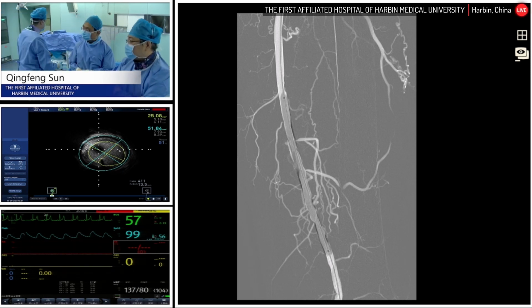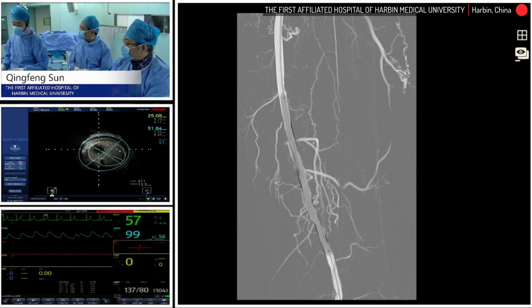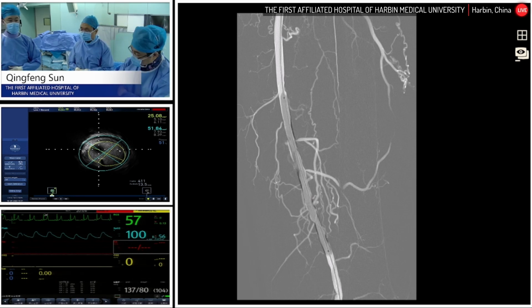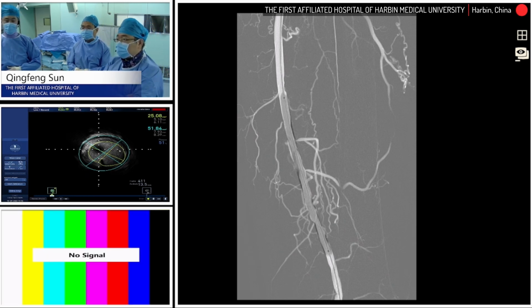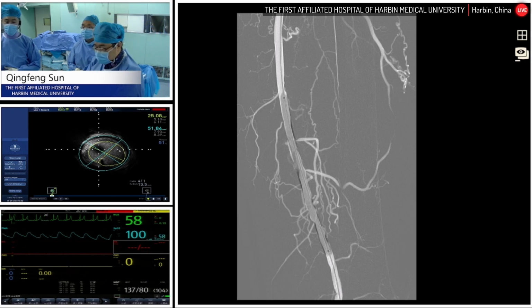If we have a stent, that will be in-stent restenosis, and that is definitely more difficult to cross for the next intervention. So if we leave nothing inside the patient, and we need to intervene next time, it will be much better and much easier.